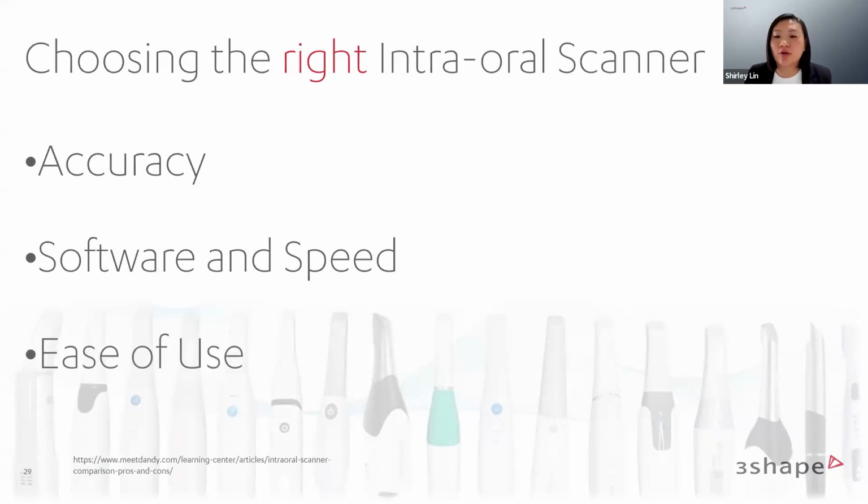Ease of use. The best dental digital scanners are user-friendly. How easy is it for you to pick up the scanner in your hand? How does it feel in your hand? Does it fit comfortably in the patient's mouth? What type of tips do they currently have? Is the software interface intuitive and aligned with the workflow and the type of work that you want to do, and the simplicity of how the software is used?